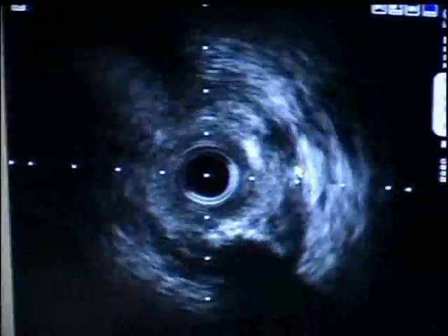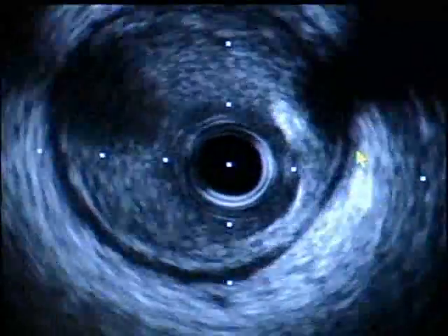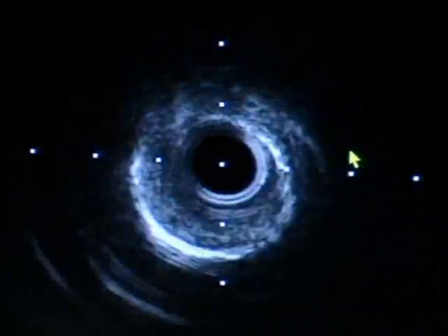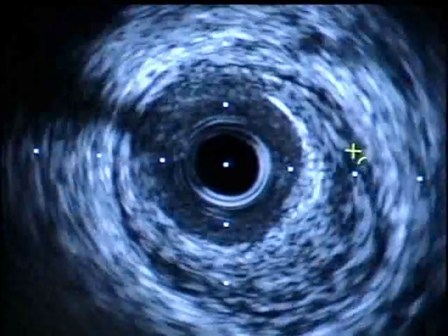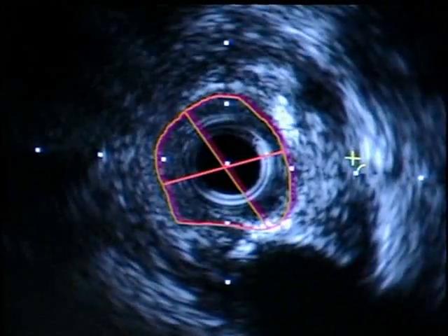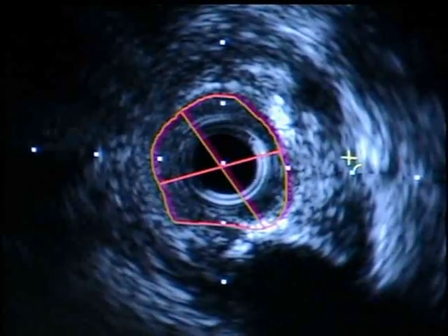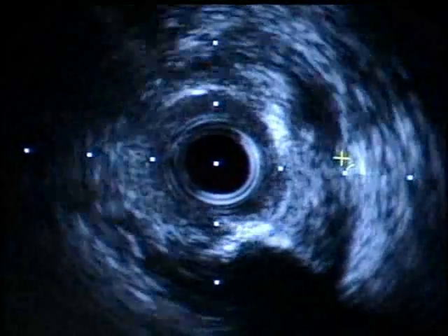Much more disease. Yeah. More calcification, and this is there. More, yeah. But same, it's just like disruptive few rims of calcium, not calling for rotational atherectomy. It's not a circular. Basically, in our lab, we do not decide for rotational atherectomy based on the IVUS, rarely decide, I should say.